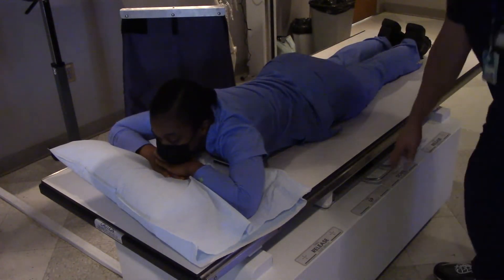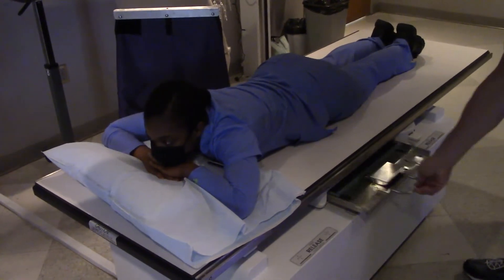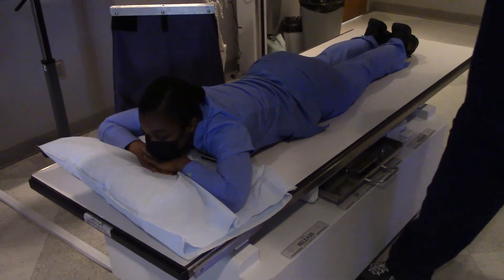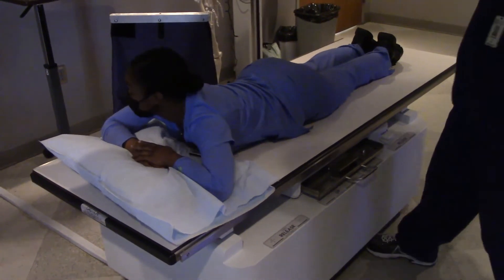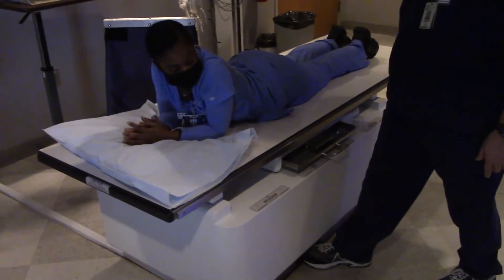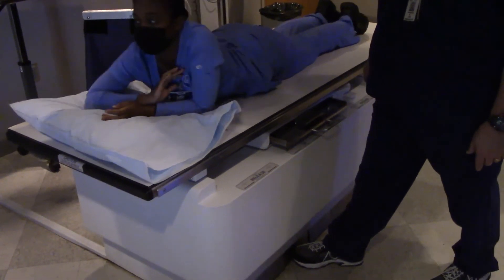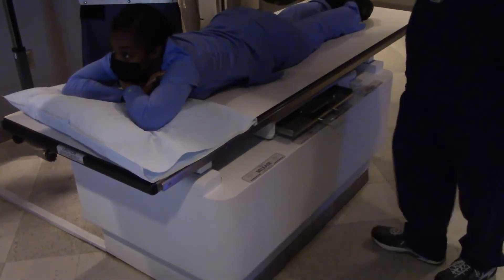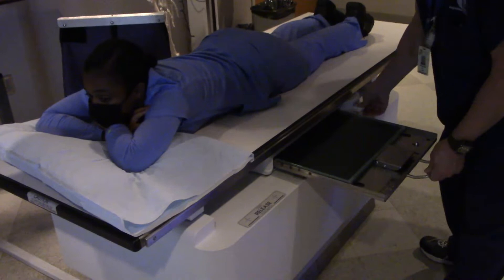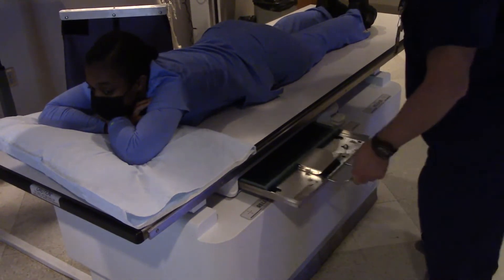All right, excellent. So what I'm going to do today, the first thing I'm going to do is raise the height of this table. Well, at least I think I am. Okay, there it goes, finally. Because I don't want to bend over so far that I'm breaking my back. All right, somebody has thoughtfully provided me with an image receptor.